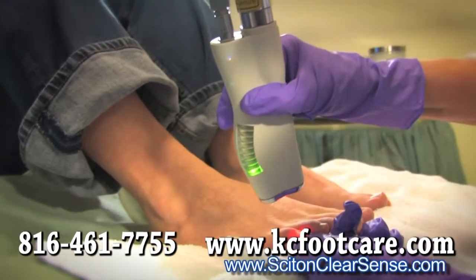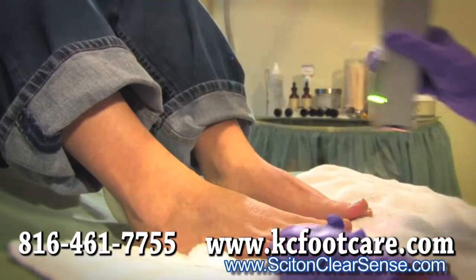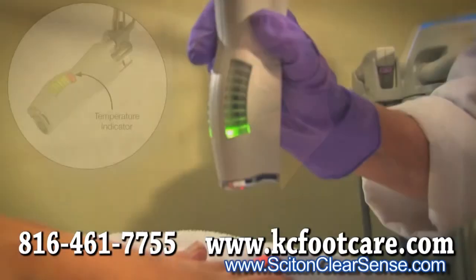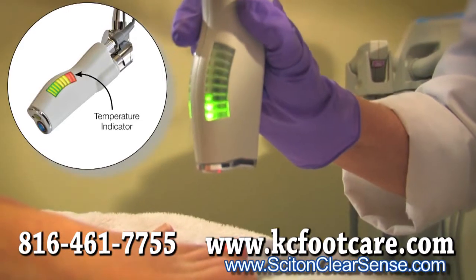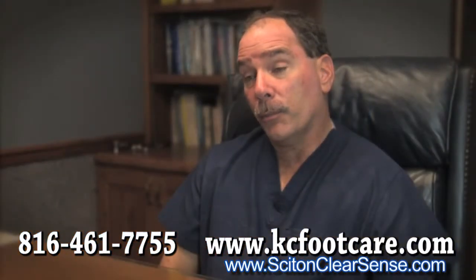I do explain to them that many times it varies based upon their ability to tolerate the heat that is produced. We also use the handpiece itself for clinical monitoring of the temperature, and by using the color-coded scale, we are able easily to see the approximate temperature we're at, so we stay within the proper parameters.